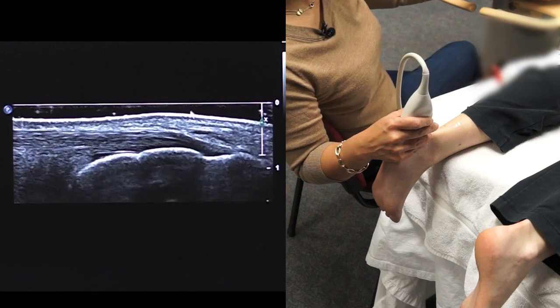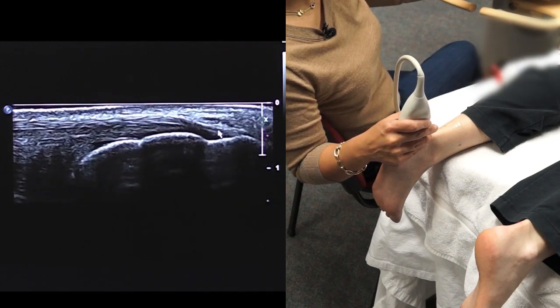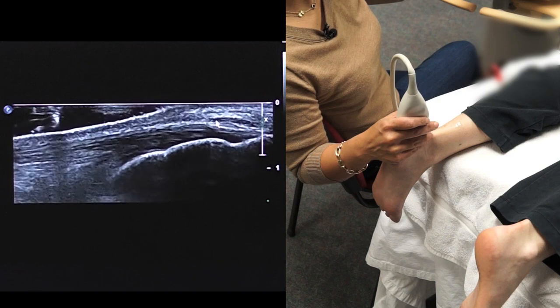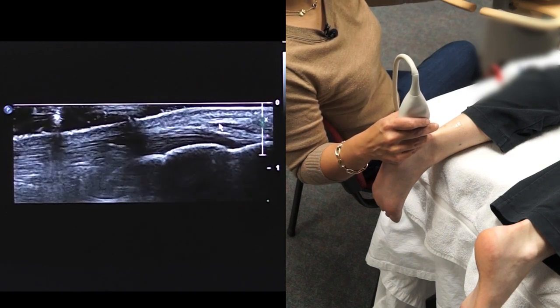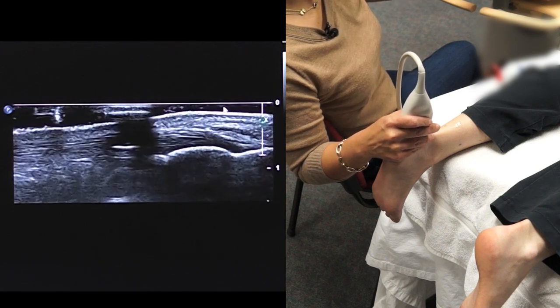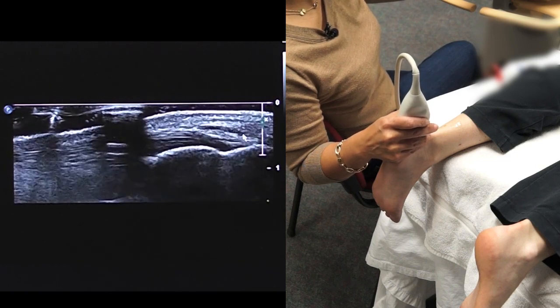You can see here's some gel, and that you'd see a very superficial bursa. You can see there may be a little bit of fluid here, and you can see that as I press, I'm obliterating that bursa. So in order to see it, you would like to have a light hand when scanning and heap up the gel in order to see the superficial or retroachilles bursa.